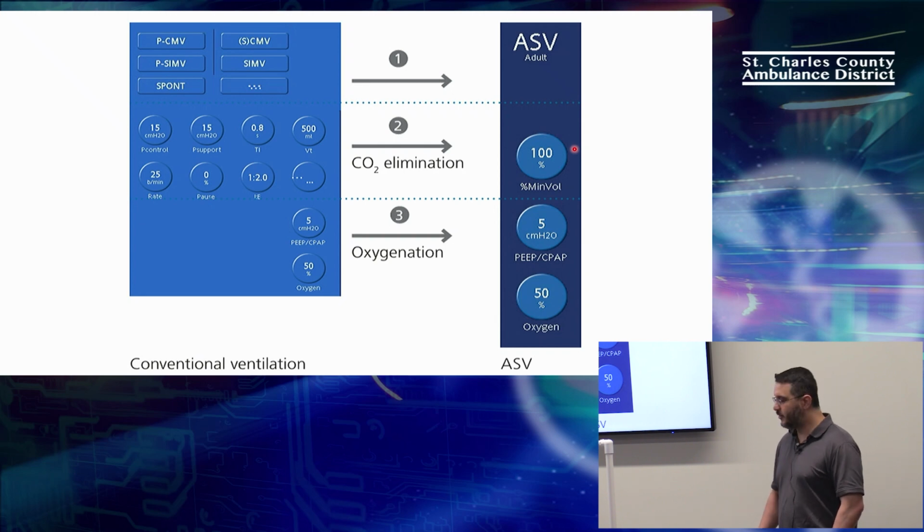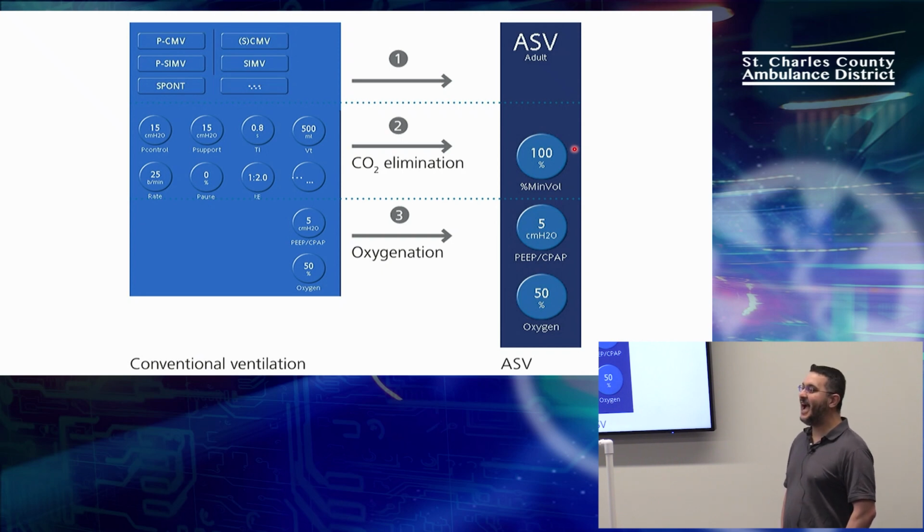Okay? What if someone is, I don't know, give me some examples. What do you think? DKA. What do you guys think? Where should we put that guy? Huh? 200. Higher than 100. Yeah, 200. How are you going to choose how to go up and down?